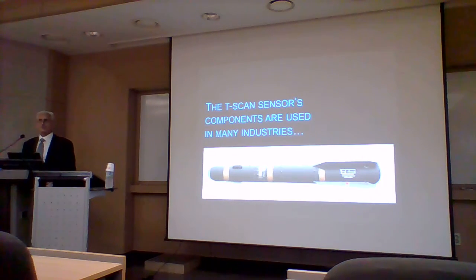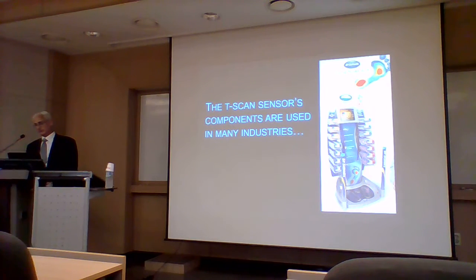센서가 치과 쪽에 이용되기 때문에 T-스캔이라고 한 것 같고, 다른 데 이용되는 건 또 다른 이름을 쓰는 것 같아요. 마지막에 얘기했던 것들은 무진동차로 이동할 때 바닥면에 충격이 어떻게 작용하는지 같은 것도 있고, 아까 발바닥 분석하는 것도 똑같은 원리가 적용된다는 거고. Yes, this device is designed to measure your foot pressures and to give you correct orthotic that you can buy from this kiosk.